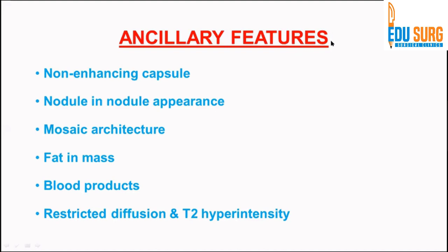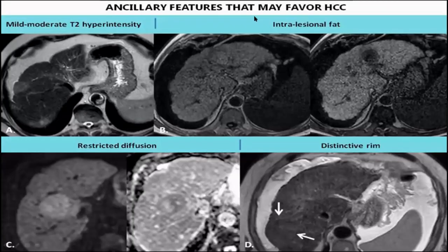Ancillary features supporting the diagnosis of HCC according to LI-RADS include: capsule without enhancement, nodule-in-nodule appearance, mosaic architecture due to fat or hemorrhage, multiple nodules within a single lesion, fat in the lesion, blood products within the lesion, restricted diffusion, and T2 hyperintensity. Here we can see mild to moderate T2 hyperintensity, and in the in-phase image the lesion is bright, while on the out-of-phase image it is completely suppressed, indicating fat content. Restricted diffusion and a distinctive rim also support the diagnosis of HCC.